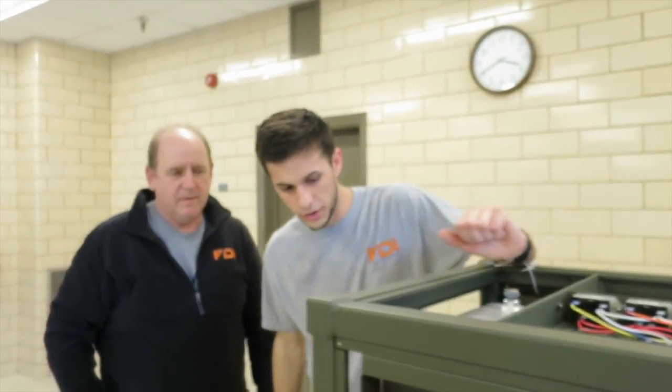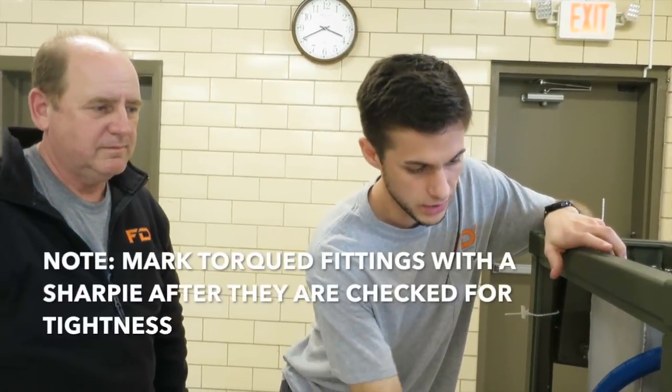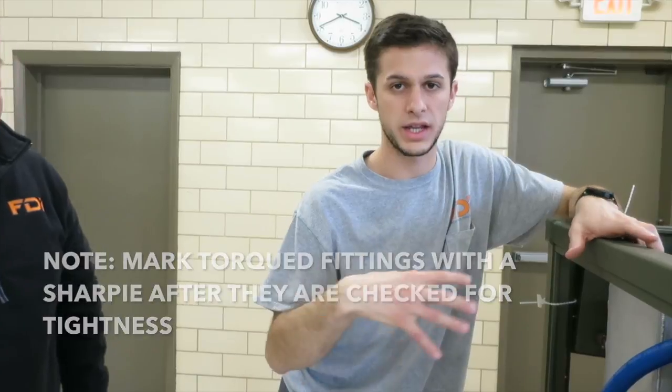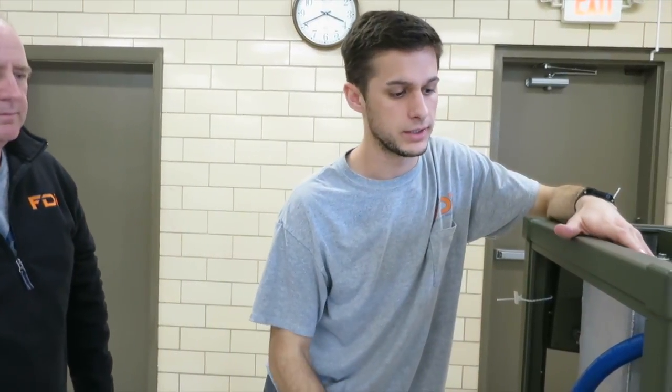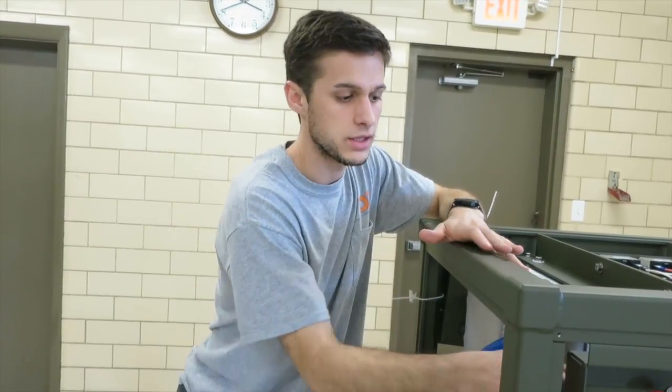Alright, so now that he's back there and tight, we do recommend that you take a Sharpie and do torque marks just to verify that everything's been tightened. So when the next guy comes through and has to replace something, he'll do the same thing. It just ensures that every fitting was checked to make sure it's tight.